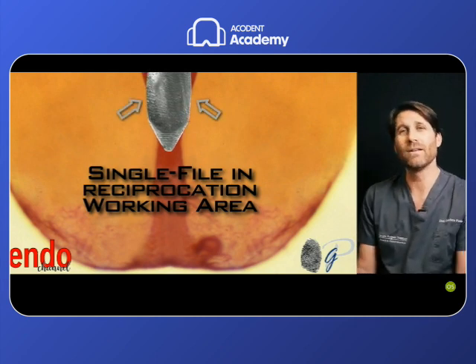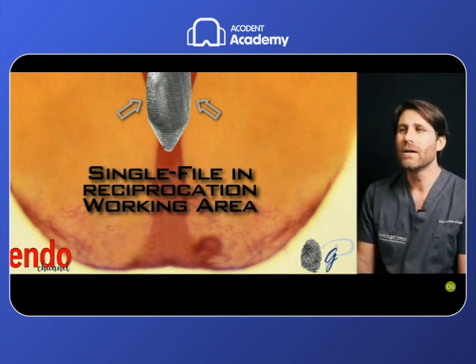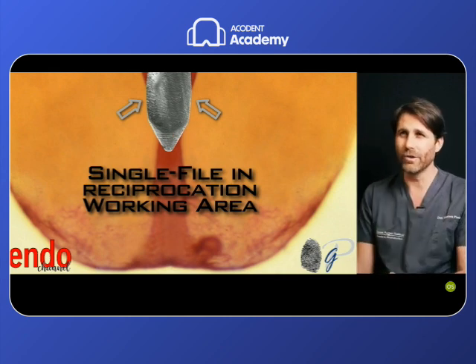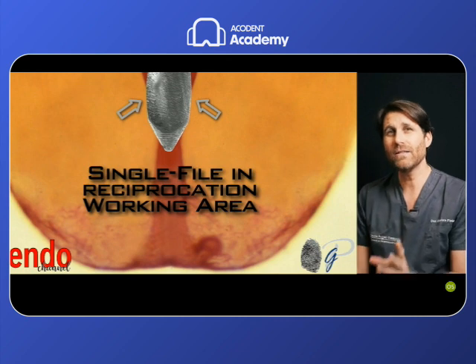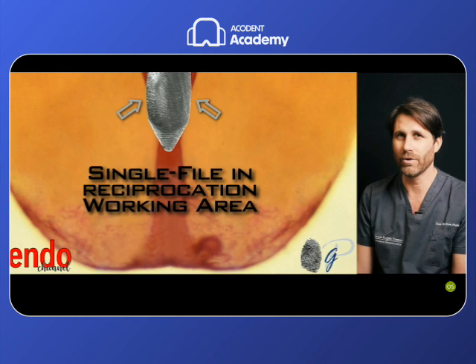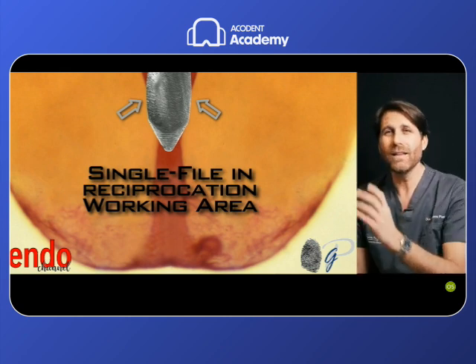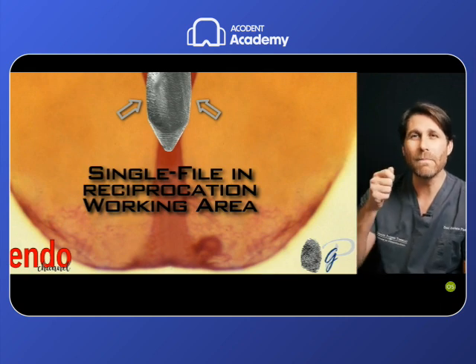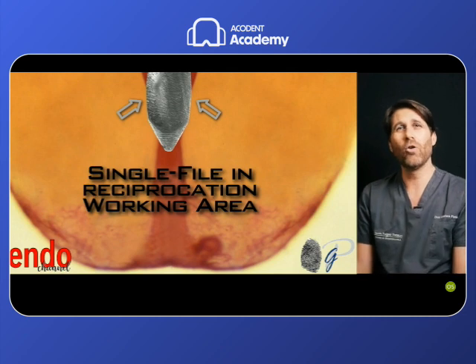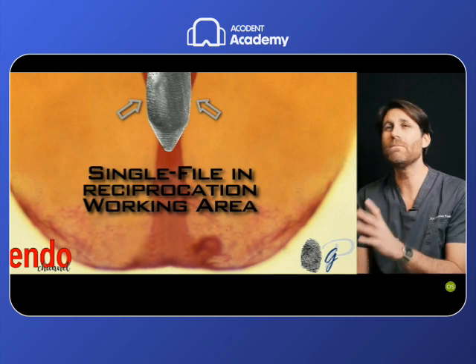The tip is 25, taper 8 for 3 millimeters, so the tip has the power to cut a big amount of dentin in a very small coronal third, has the cutting efficiency to do it, has the flexibility to do it, and the safety to do it thanks to the reciprocation. So for doing this, we need a tip that is resistant and that can be pushed a bit inside this anatomy and can follow the path of least resistance given by the root canal because of its characteristics. So the tip is very important.